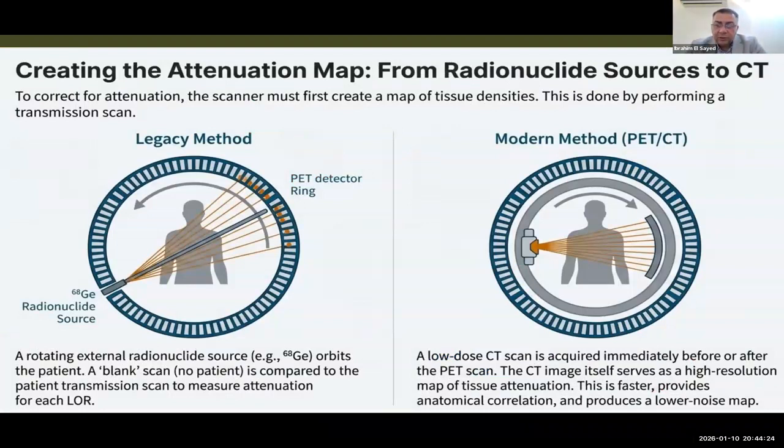The CT-based attenuation correction, which is used widely nowadays, provides the electron density in each voxel. Like we see here, this is a tube, and this is a detector moving around the patient. It creates a map of electron density, and it's converted for attenuation correction in the PET. It's much faster. In milliseconds, we can have an image around the patient.